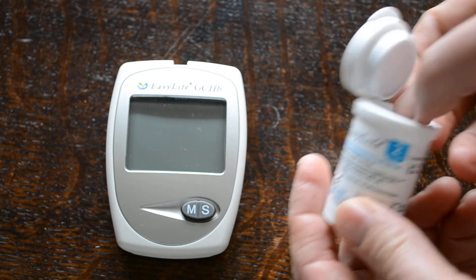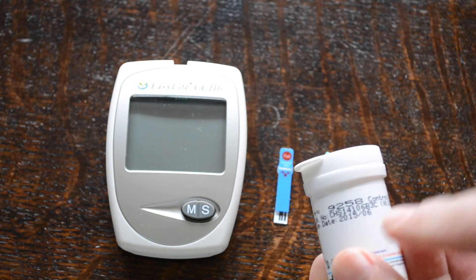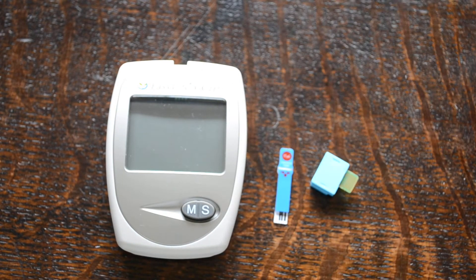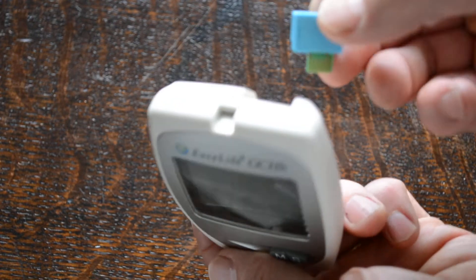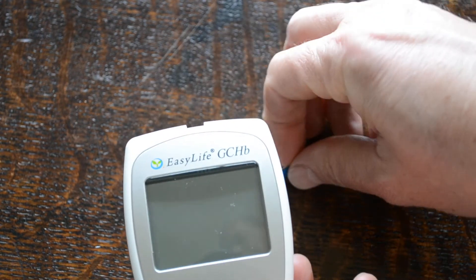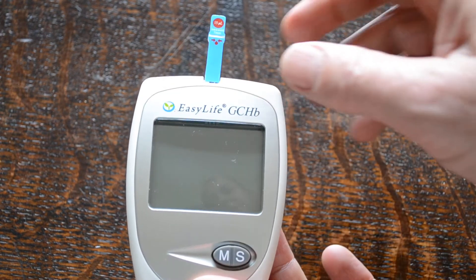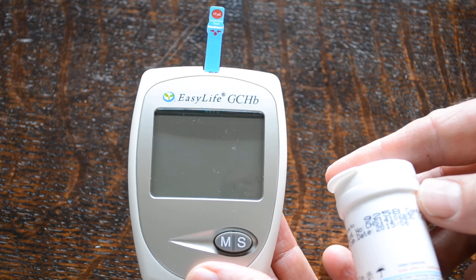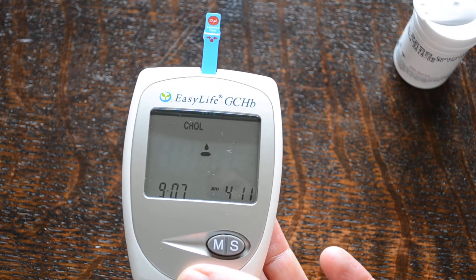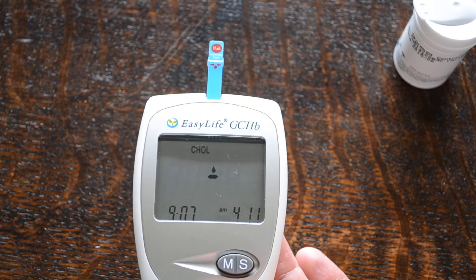These are the cholesterol ones, and inside the pot you will find test strips but also the code chip. On the side of each pack you will find a four-digit code for that batch of test strips. The first step when selecting the cholesterol test is to load the cholesterol chip into the reverse of the meter, then by inserting the test strip you will see on the digital display that four-digit code — 9258 — corresponding with the test strip applied. Those two must always match for the accuracy to be encoded into the meter.